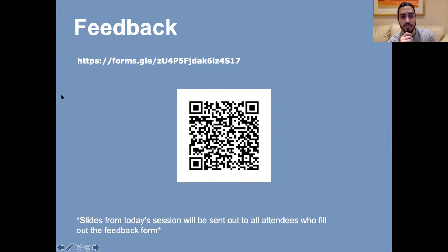And just here, the last question is, what is the difference between VTAC and VFib? Is it that VTAC just looks more regular? On an ECG, yes, so VTAC would be broad regular QRS complexes, and VFib is just random squiggly lines, like you can't really read it. In real life, VFib is worse than VTAC because VTAC can lead to VFib.